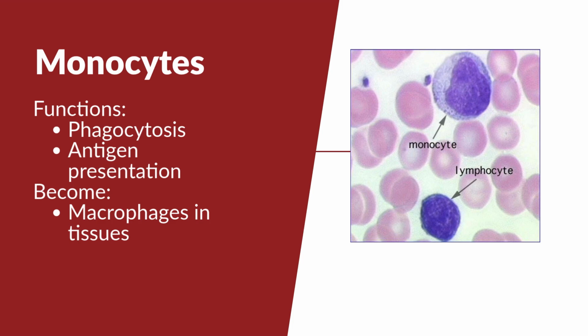Then when I go to the meta, it's going to push in a little bit, like I'm bending in, I'm banding in. Meta is always going to look like it wants to be a band, but it isn't quite there yet because my lobe is too big still. There is no lobe because I don't have that banana look. Next after the meta would be the banana, my band, because I'm almost graduating. All I've got to do is get through the next couple of classes and then I'm going to be a full-blown neutrophil, or whatever stage that particular cell is going to be.